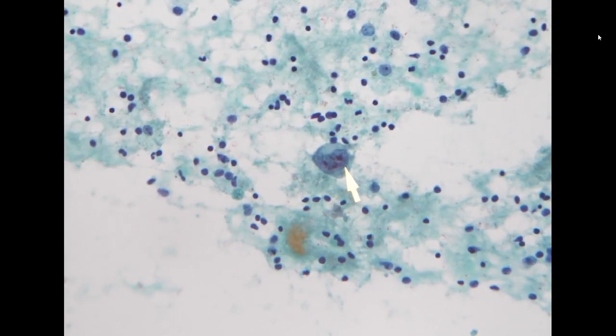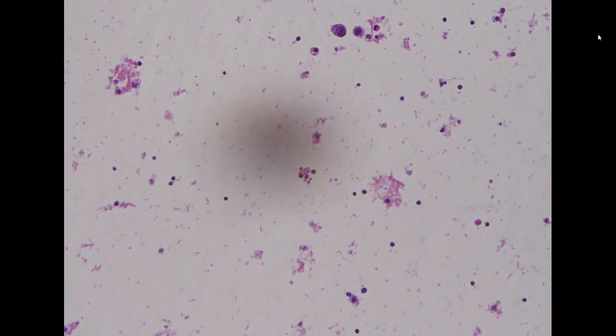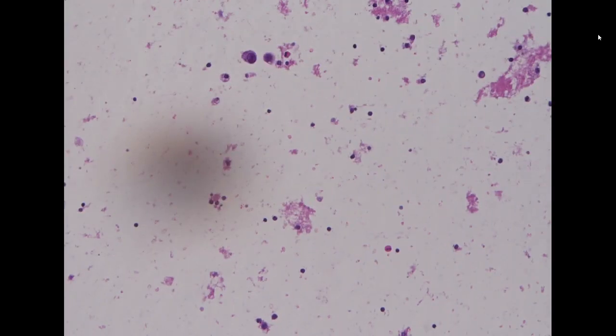So for poorly differentiated adenocarcinoma, the size of the nucleus is very big. So you can see it is a huge nucleus, and still have quite plenty of cytoplasm with eccentric nuclear pattern, and there are prominent nucleoli in these nuclei. So this is a poorly differentiated adenocarcinoma. The clinician ordered repeat examination with cell block. I think it is because they need the specimen to do EGFR, but this specimen is also not good. The last specimen also showed very scant tumor cells, and this one as well, very scant. So this is also not good for EGFR testing.